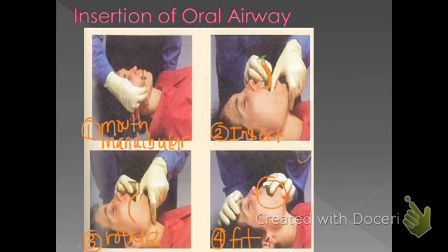So again, we have to measure from the tip of the mouth to the mandibular angle to get the appropriate airway. And in such a case, someone said, well, would you rather have it too short or too long? The best answer is probably too long.